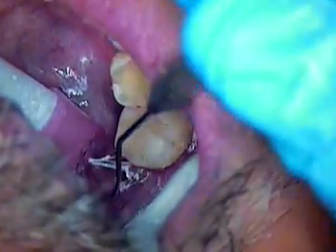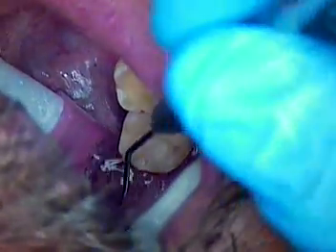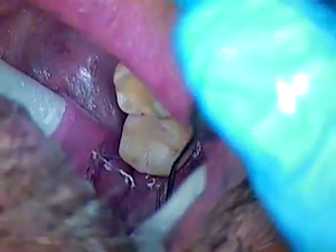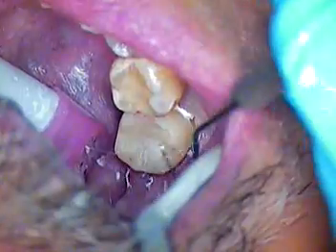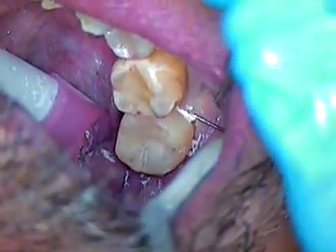I like it because it keeps the temporaries on, and it's an easy cleanup after we remove the temp too. You're really getting the best of both worlds. Many practitioners will use different types of cements — one's called Fynal, F-Y-N-A-L. That's a good cement. I would just suggest you use what you're comfortable with.